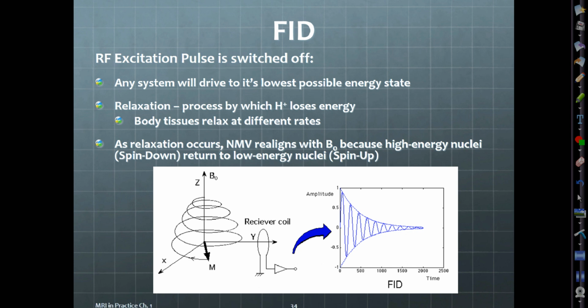What was the other thing that happens during resonance? The spins become coherent. And when spins are coherent, that produces the largest amount of signal in our receiving coils. Because they're happy when they're coherent and they're next to each other. We have hydrogen spins all throughout our body, and they're next to each other. So if they're in phase with each other, they're not going to cause what we call free induction decay or rapid decay. But if they're out of phase with each other, that signal starts to rapidly decline. Okay? So good.